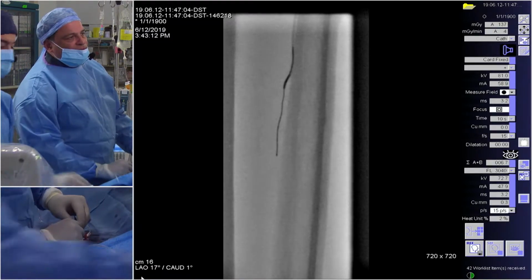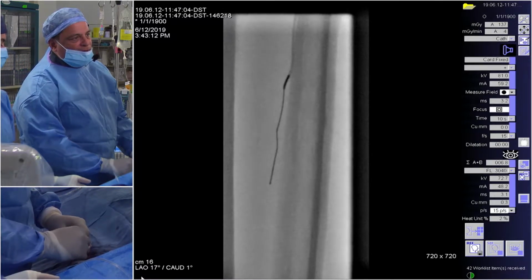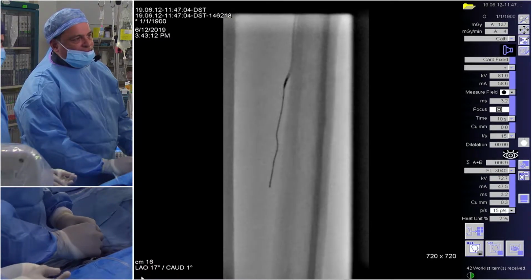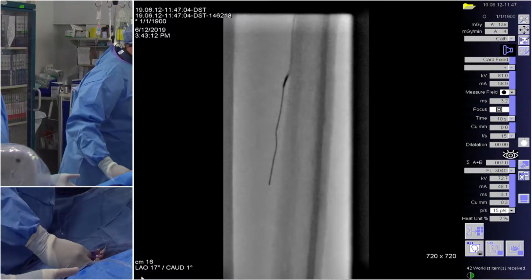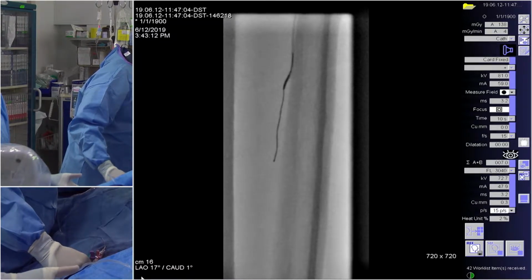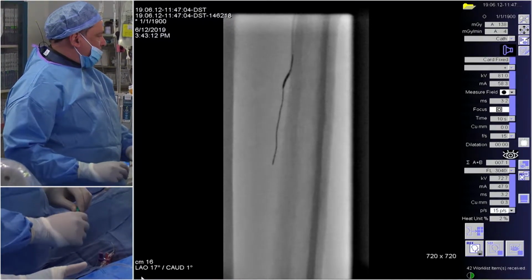And I think, Chris and the panel, this is the area where I think a true antegrade access might have helped even more, even though we were able to bury the catheter in the SFA. So PK, this is Fadi here, and obviously you know I'm very biased. And Chris is looking at me already. He's like, don't even think about it.